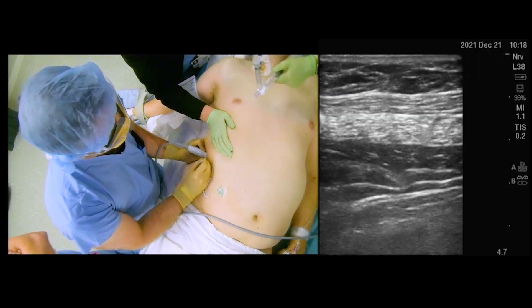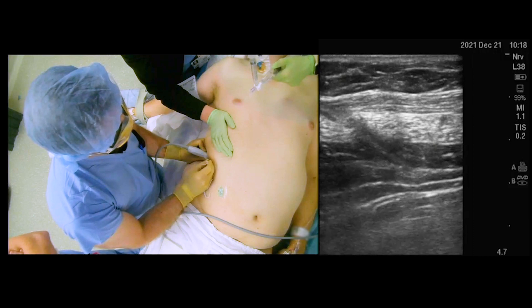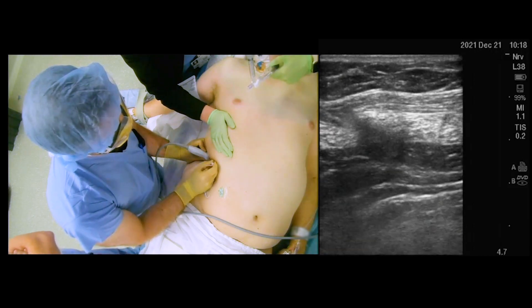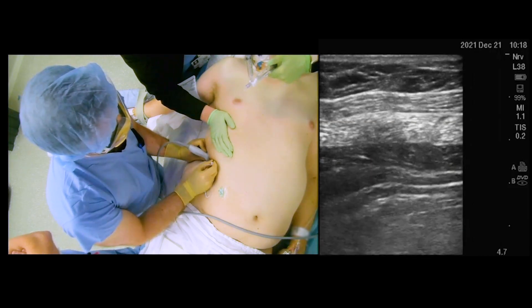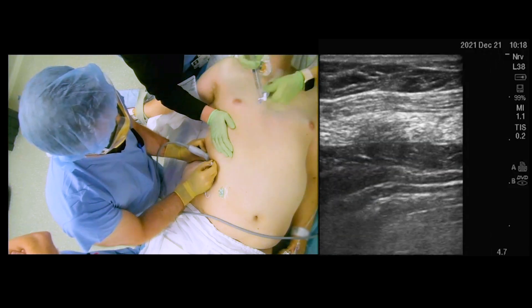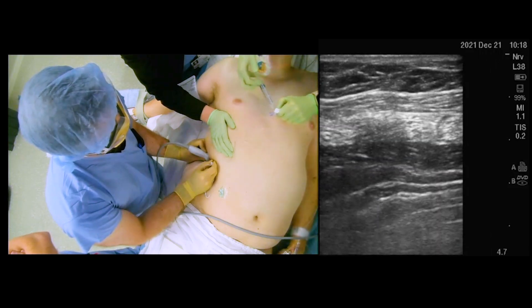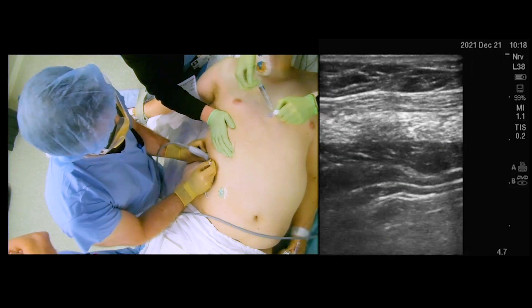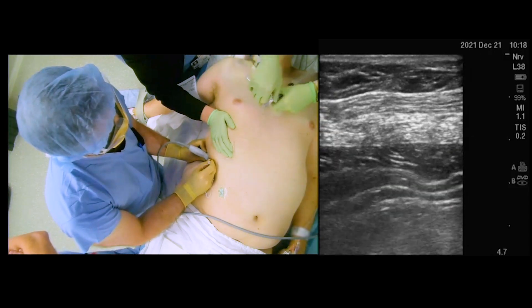The probe was positioned between the top of the iliac crest and the costal margin. The probe was moved laterally until the three layers of the abdominal wall were identified: the external oblique, the internal oblique, and the transverse abdominis muscle.